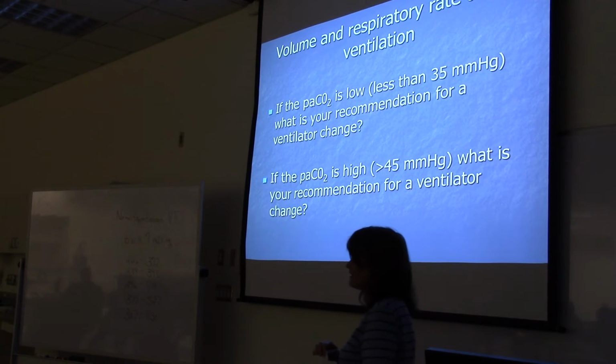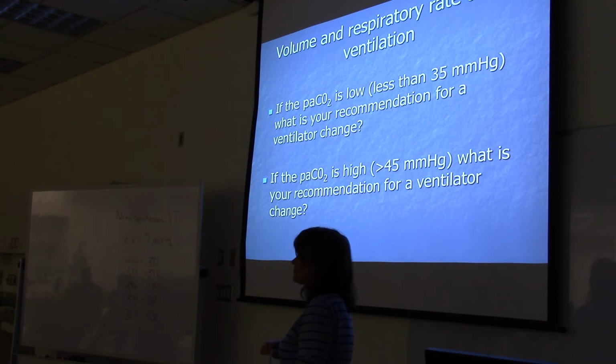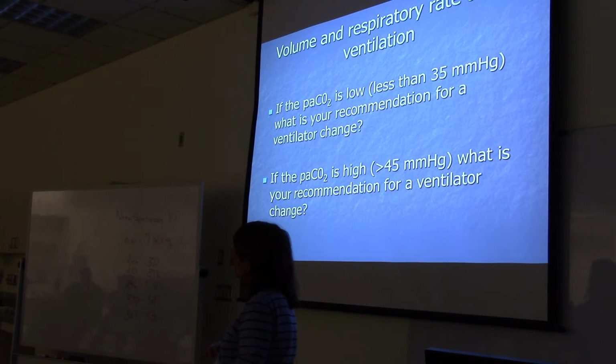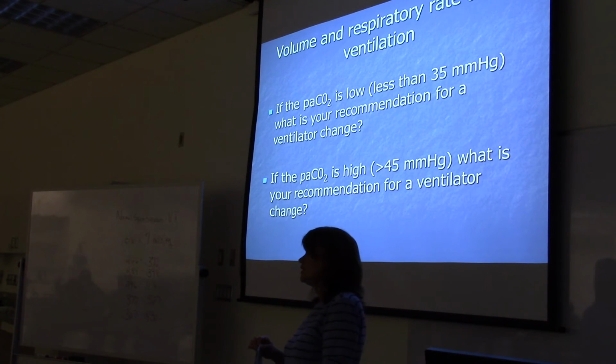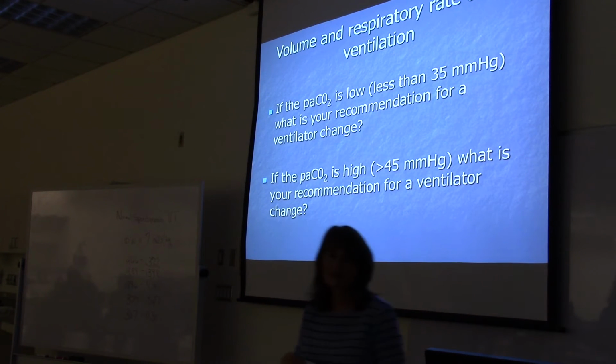What if the tidal volume is on the lower side of the normal, 6? You increase it to 7? You could potentially increase it, yeah. Then you'd have to be monitoring the different loops to see if there's too much compliance or something. You could check the compliance after you've changed the size of the tidal volume, true. But typically you'll look at airway pressures. If you're putting in too much volume, your pressures will go up. Right. About 30.